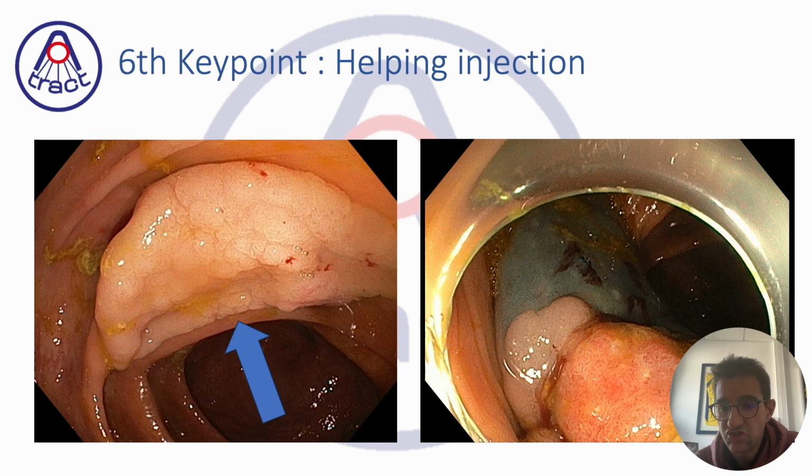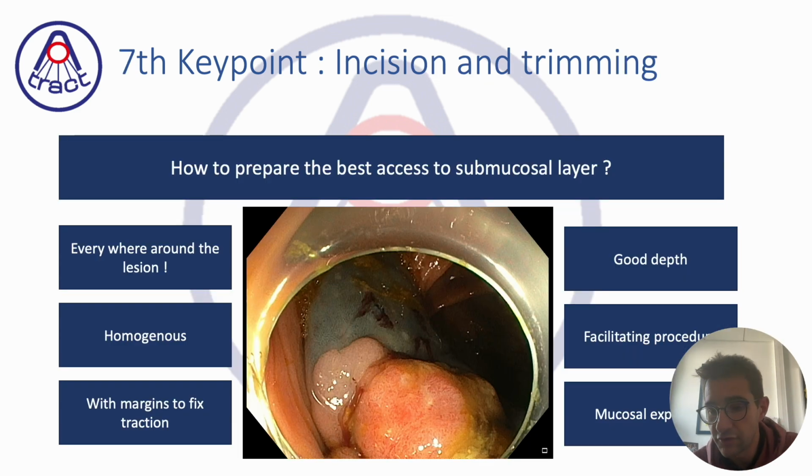by doing first the incision at the oral edge, making the mucosa grow toward you, turning the lesion to face you, and therefore you will have a more effective incision in direct viewing. If you are able to do it with retroflexion, it's even better.